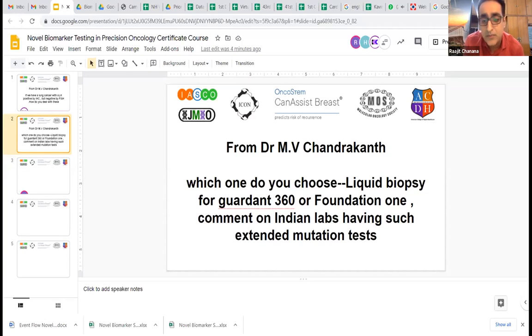The best test would be to do the targeted panel, because we know that for that set of disease we will be able to find those sets of mutations and get the answer in an earlier time. But if we are short of options, then we would like to do whole exome sequencing. It can be done in Indian labs that are offering these, such as MedGenome, Oncquest lab, and Lal Path lab. So it's based on the comfort and whether they have validated their test or not. The technicalities of the validation you need to discuss with the lab itself.